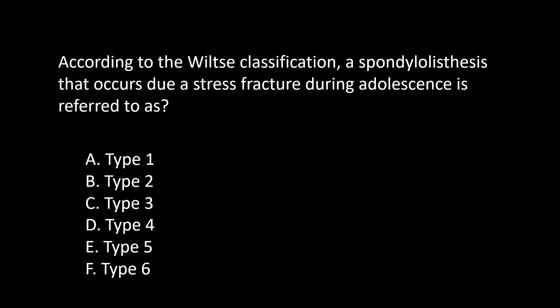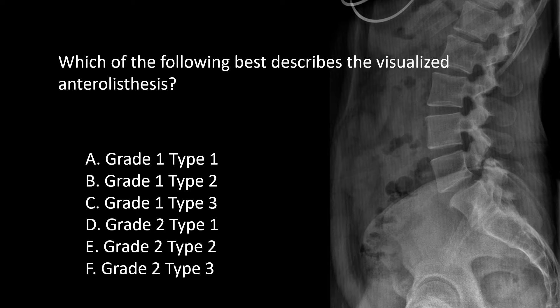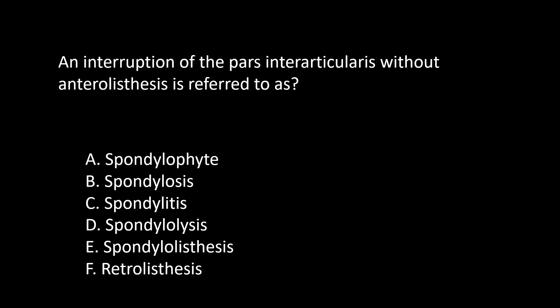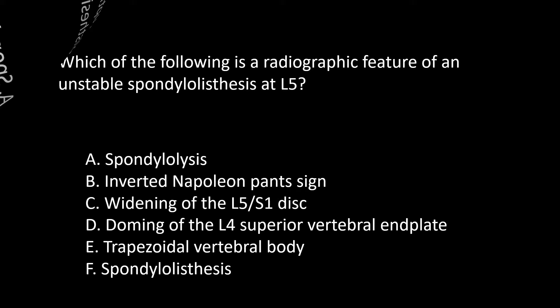Which of the following best describes the visualized anterolisthesis? This looks like a spondylolytic spondylolisthesis of L5, probably a grade 1 — so this is a grade 1 type 2. An interruption of the pars interarticularis without anterolisthesis is referred to as spondylolysis.